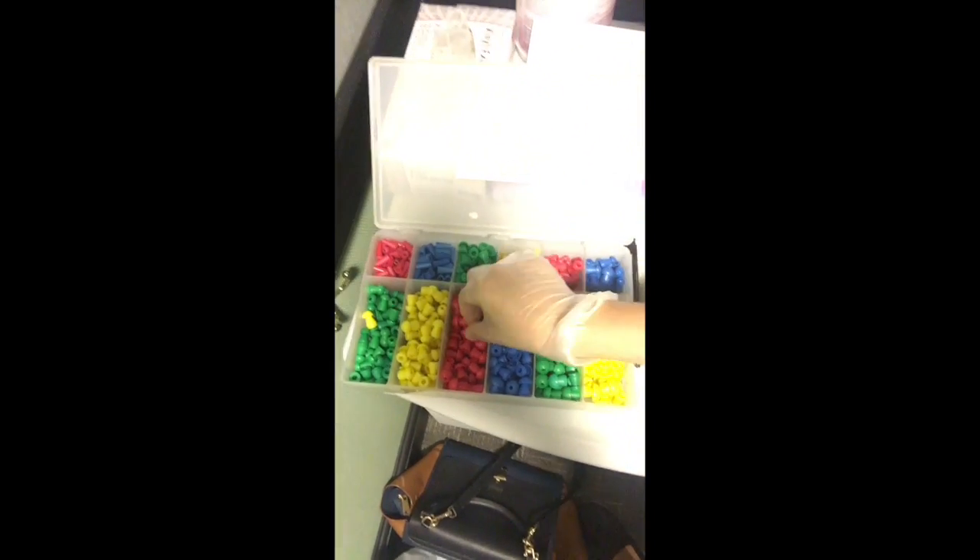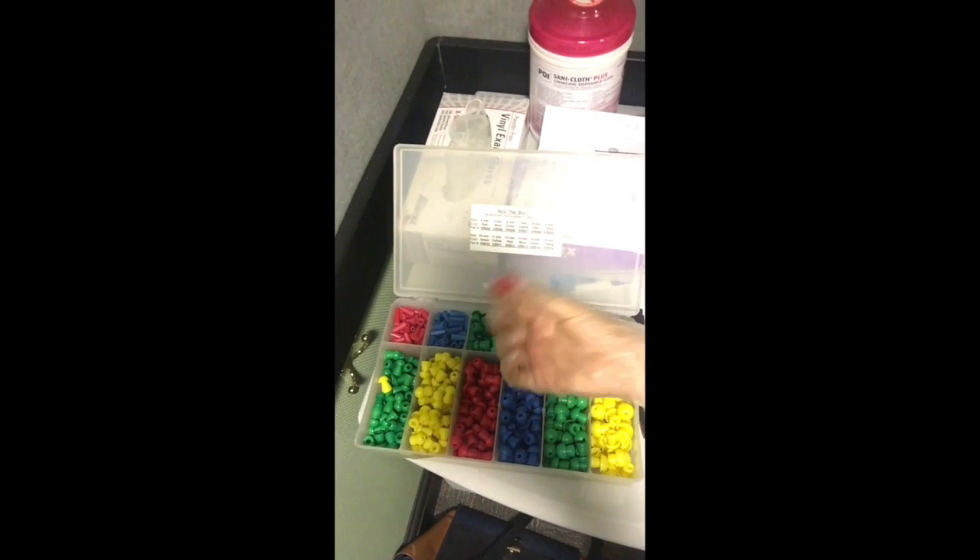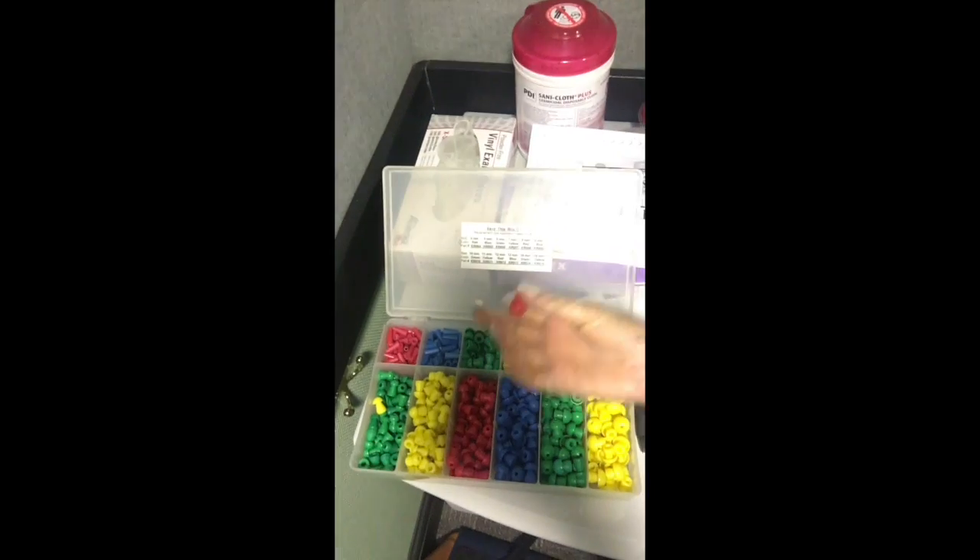Now we will be doing tympanometry, which is a tympanometric test used to assess the function of the middle ear. We're going to first pick out an appropriate probe tip, usually red or blue for adults. I'm going to use a red one for Diana.